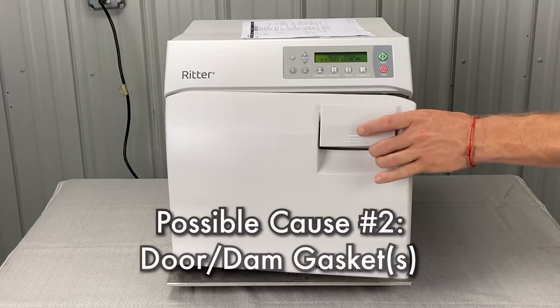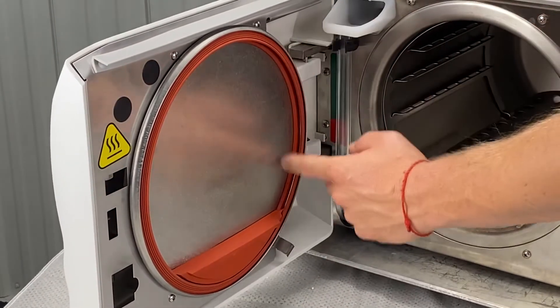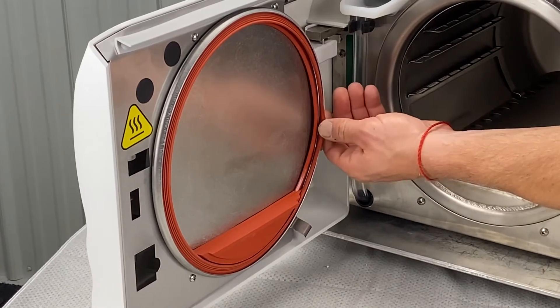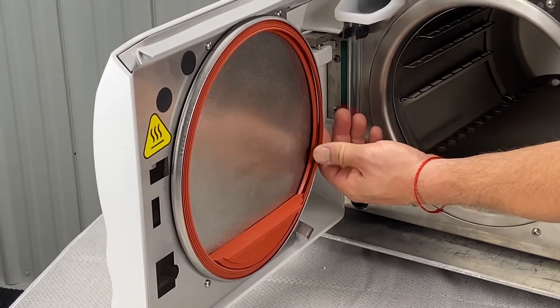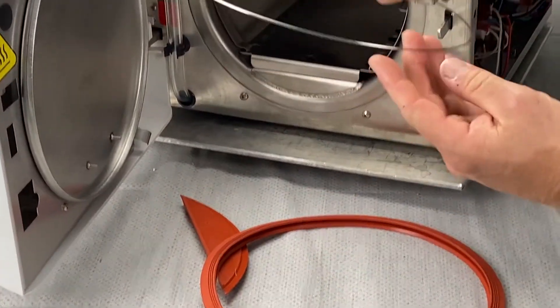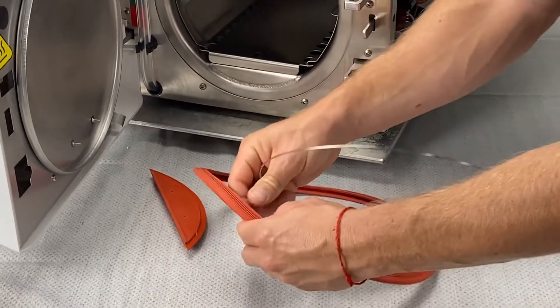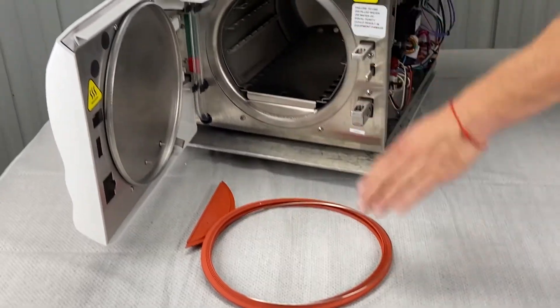The next thing is door and dam gaskets. Here's your door and here's your dam gaskets — make sure these are seated properly. We don't want any sticking; the dam gasket should be sitting inside of the door gasket. If you've got a new gasket, there should be a ring inside of it. The ring could be an issue — the welds on the ring can get too big, or it bends when opening the door, causing the gasket to warp. So it could be the door gasket and the dam gasket.